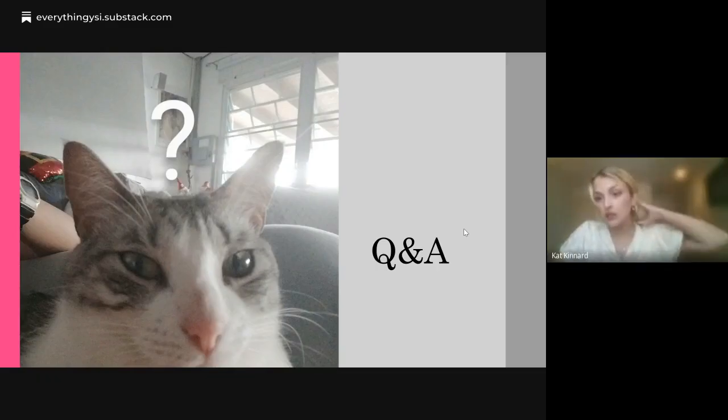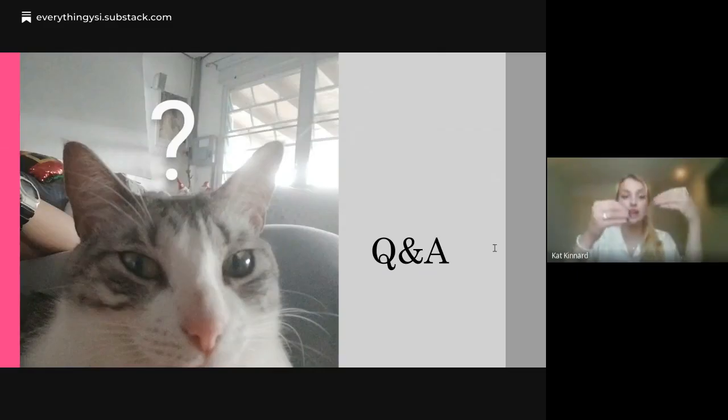Is EEG used after a seizure to determine if it has occurred or not? Thank you, Rutha. I'm sorry if I botch your names. But an EEG shows from the second you press record to the moment you end the recording. So as I was explaining, it can detect those areas of irritability where a seizure may come from.